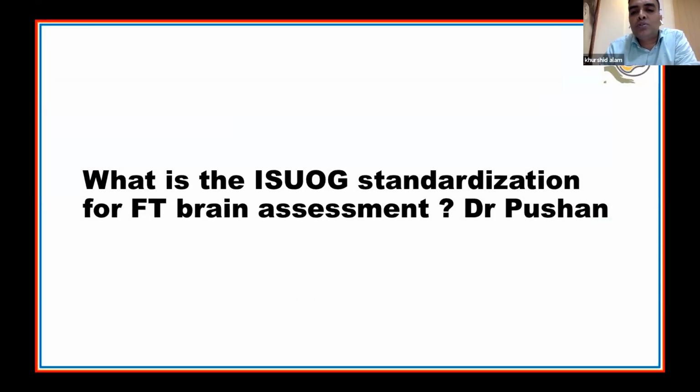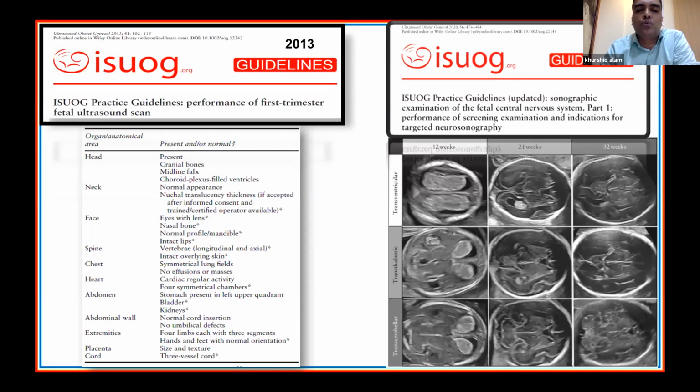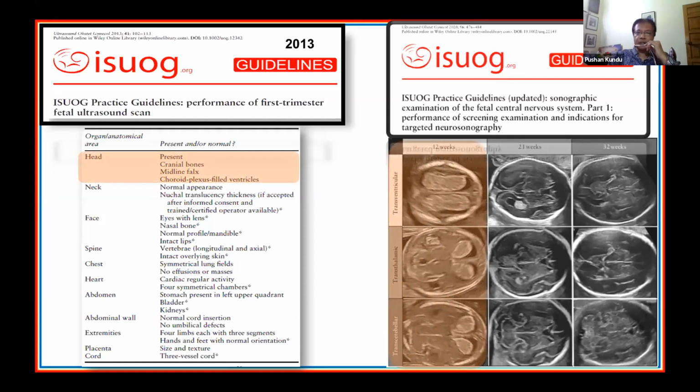The question was, I wanted you to highlight the ISUOG standardization of fetal brain assessment, like what are the basic sections, minimum basic, which we have to do. You need to see the fetal calvarium, the cranial bones, the midline falx, and you need to see the choroid plexus ventricles. And in the head and neck, you need to see the normal appearance of the neck, the nuchal translucency, as per the standard FMF parameters. These are the basic things that we must see for each and every screening in the first trimester.